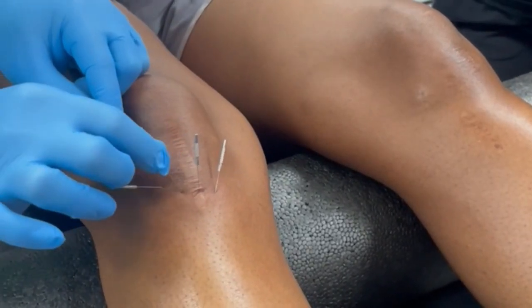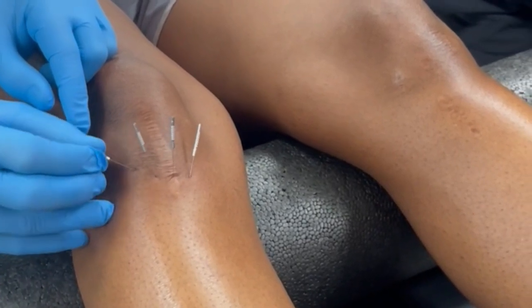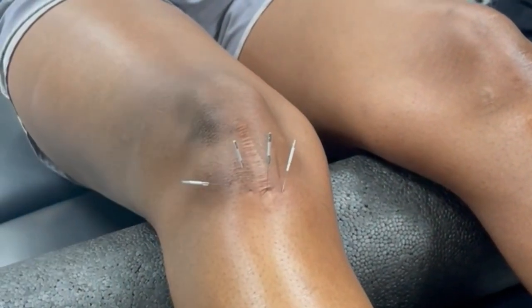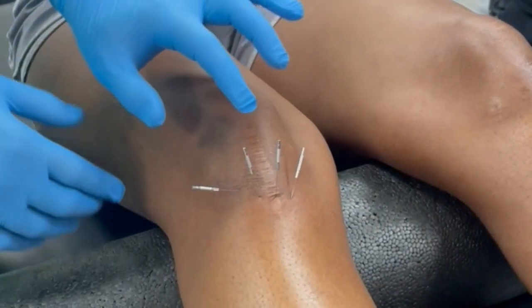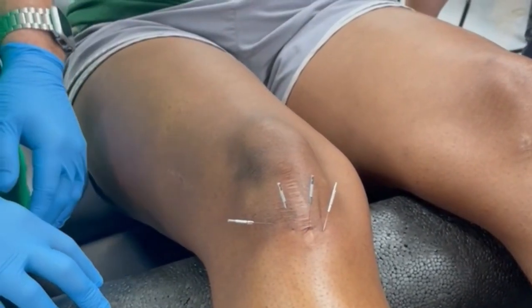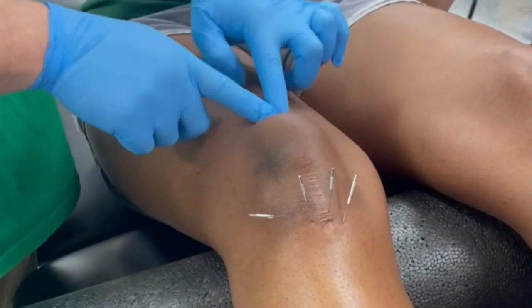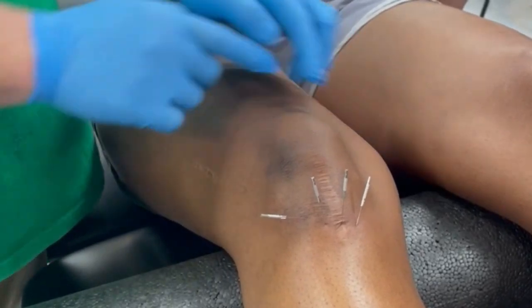Righty-tighty, lefty-loosy? It doesn't matter — if you spin it, it'll tighten up. So that's more insertional patellar tendinopathy. And then to do more, if it was kind of the bottom of the kneecap, you would do the same technique — just up towards the bottom of the kneecap. Or for the quad tendon, same thing, just sending it down towards the kneecap from the quad tendon.